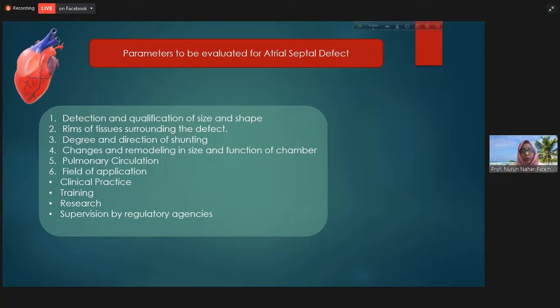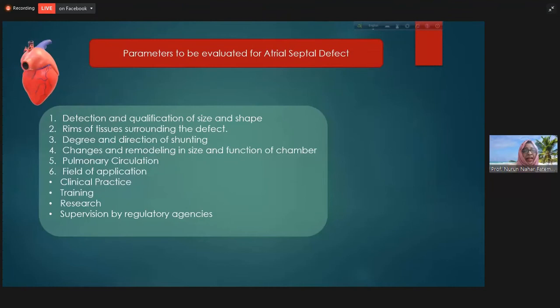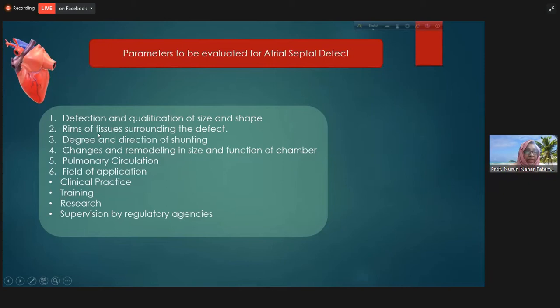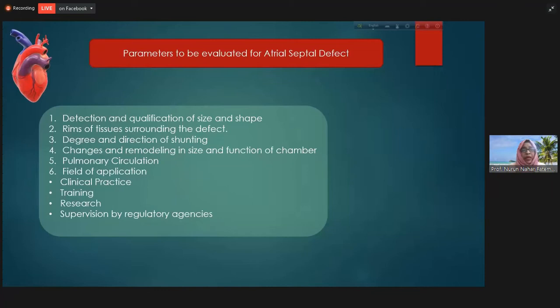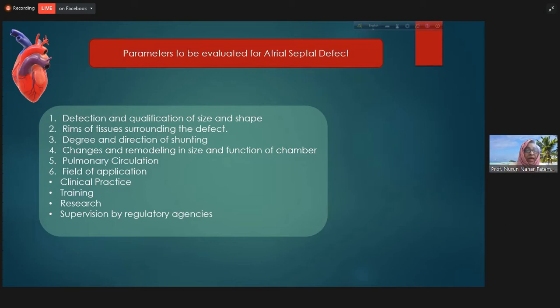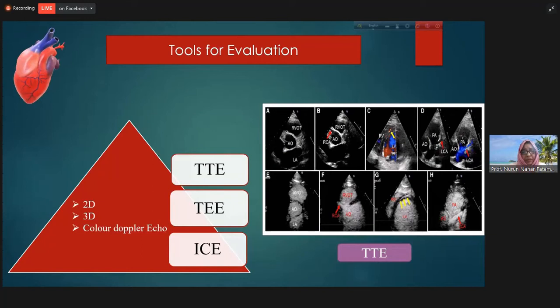The parameters which need to be evaluated for atrial septal defect include: presence or absence of ASD, size and shape of the defect, assessment of rims for secondary ASD to determine suitability for device closure, degree and direction of the shunt — whether left-to-right or right-to-left due to pulmonary hypertension — and whether there is any chamber remodeling. We know there is right-sided volume enlargement in these cases and pulmonary hypertension, so we must measure pulmonary artery pressure and assess volume overload of right-sided chambers.